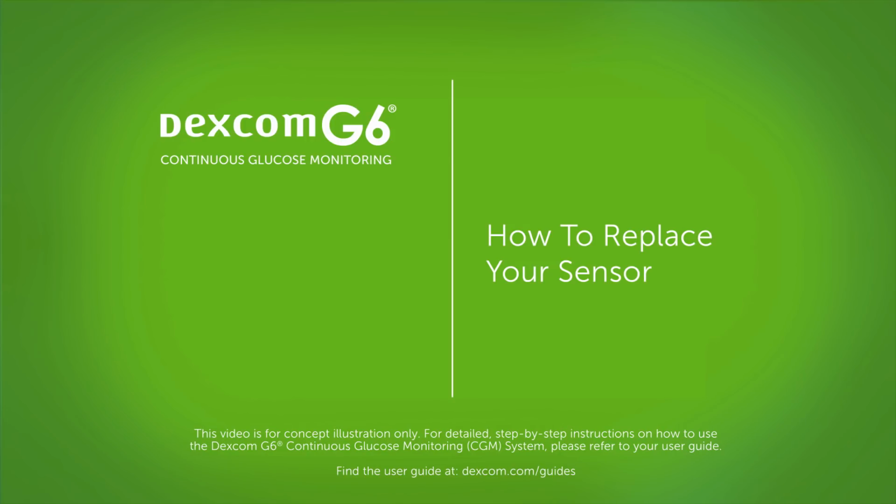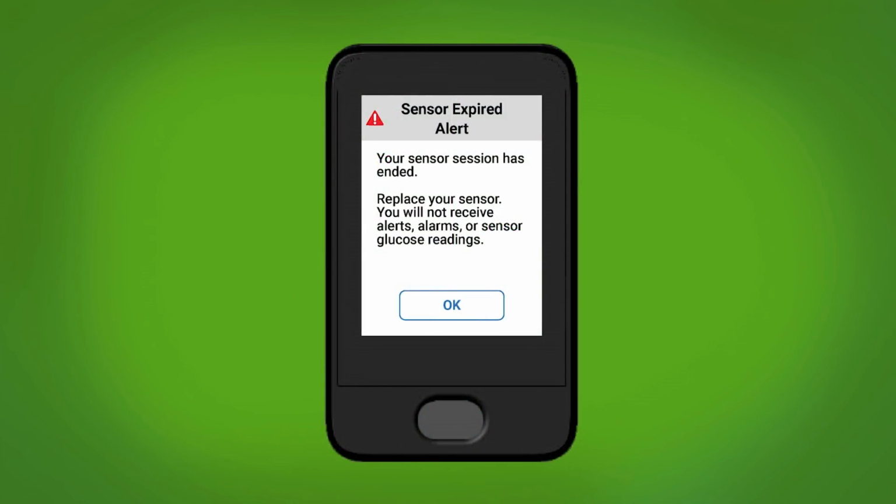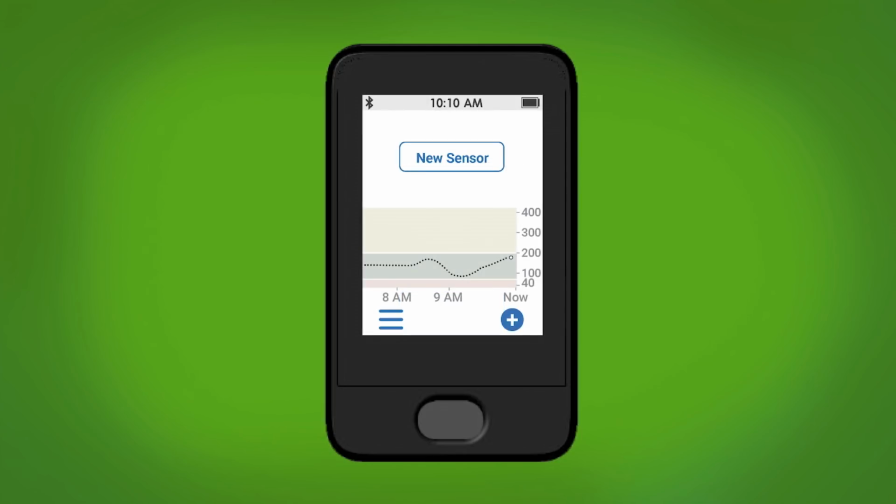On day 10, your sensor automatically stops. Your receiver will alert you 6 hours, 2 hours, and 30 minutes before this happens. Once you tap OK on your alert, you'll be prompted for a new sensor. In this video, we're going to show you how to replace your sensor.